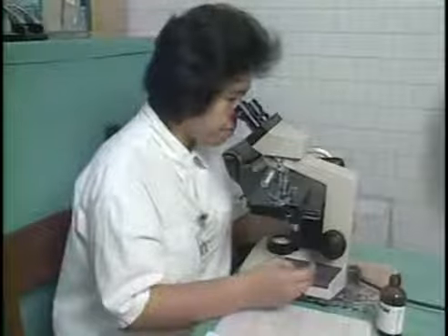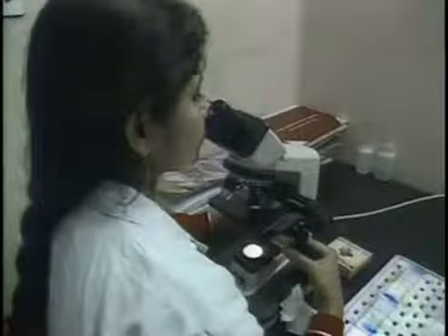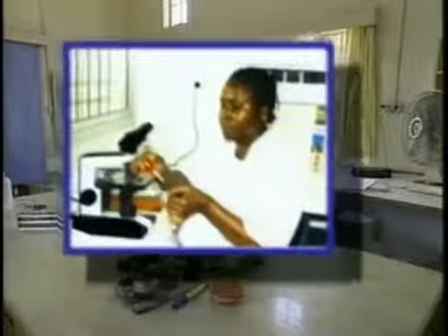This teaching module will focus on the Ziehl-Neelsen diagnostic technique of direct smear microscopy of sputum. Since most TB cases are pulmonary, sputum smear microscopy is the most available tool for TB diagnosis. It is inexpensive, rapid, and simple to perform.